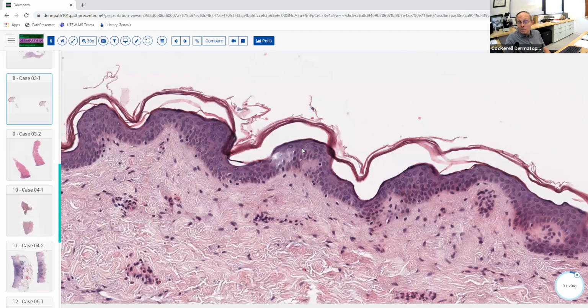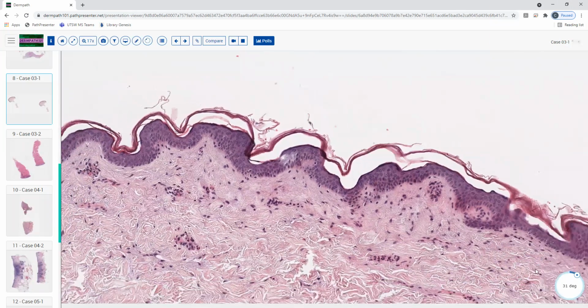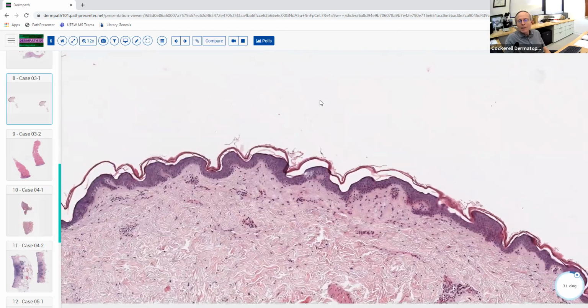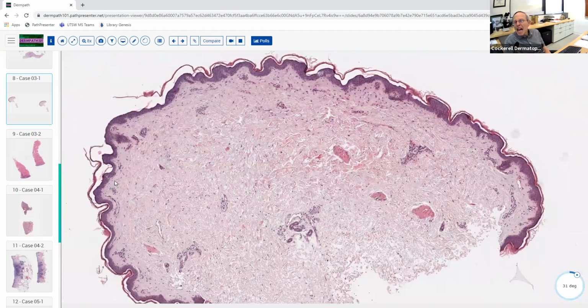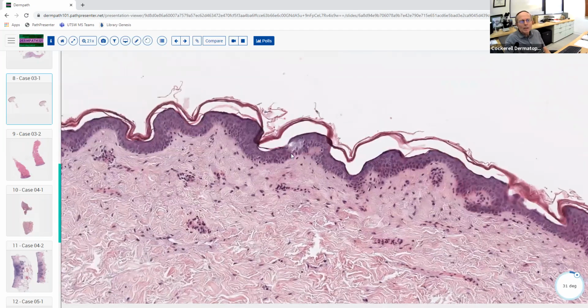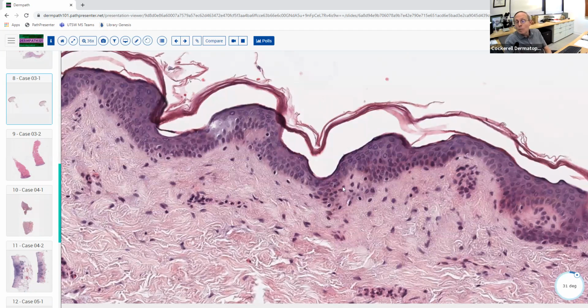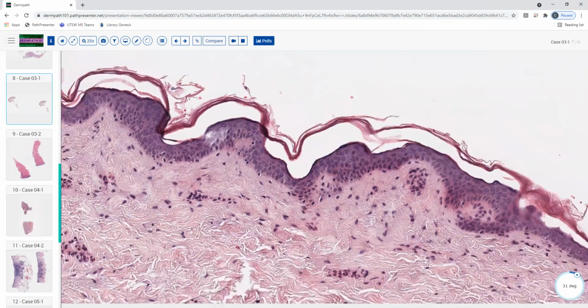What about the epidermis? Normal or abnormal? Pretty normal. Yeah, this is within the range of normal. Now, this is probably maybe the neck, could possibly be the antecubital fossa. It's got a little bit of papillomatosis to it, which is normal for the skin. There's no spongiosis here. There's no acantholysis. There's no abnormal pigmentation. We see there's some melanin here, so it's not depigmented. So the epidermis is pretty much normal. So it's a dermal process. There's no deposit here. There's no amyloid. There's no mucin.